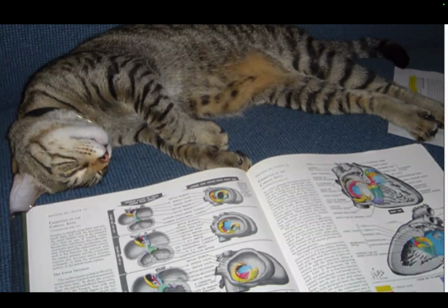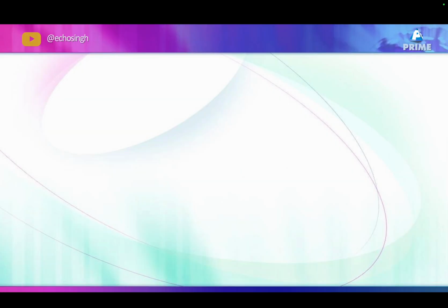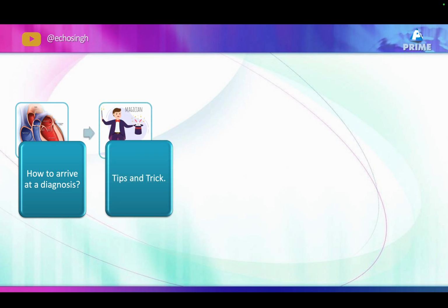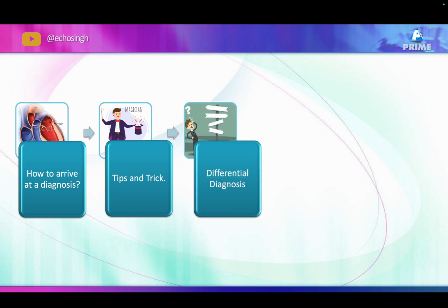Enough of embryology, sir. I am going to discuss how to arrive at a diagnosis in a conotruncal abnormality, share tips and tricks, and discuss the differential diagnosis.